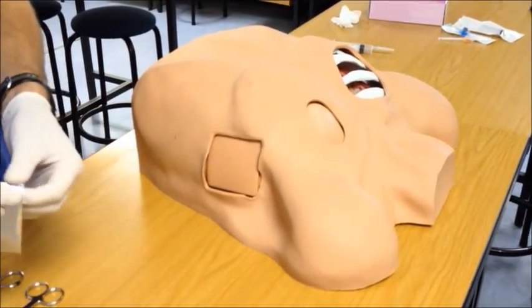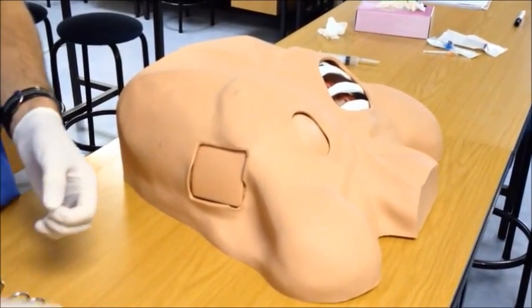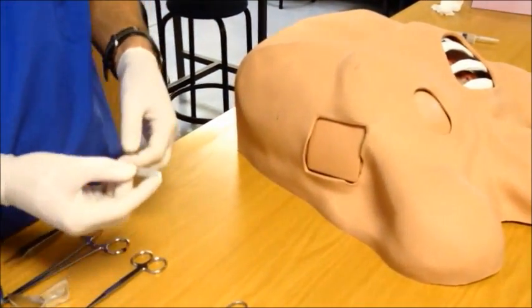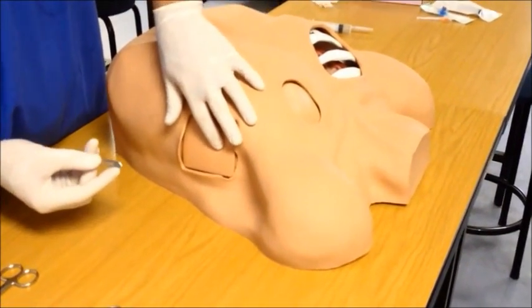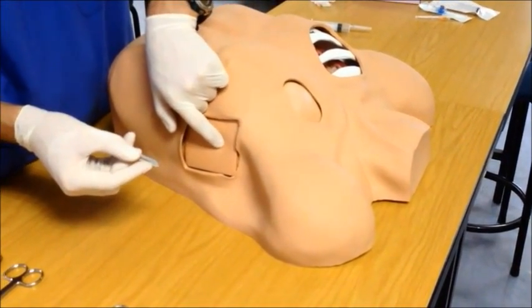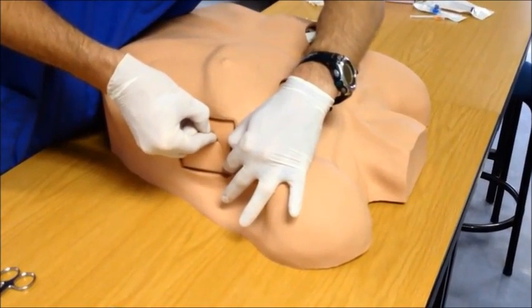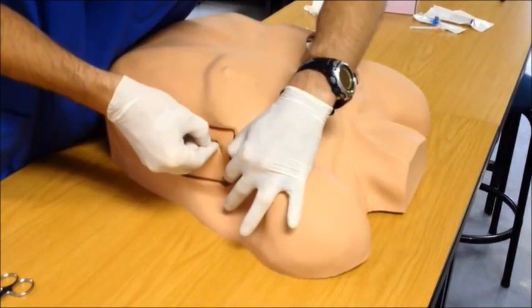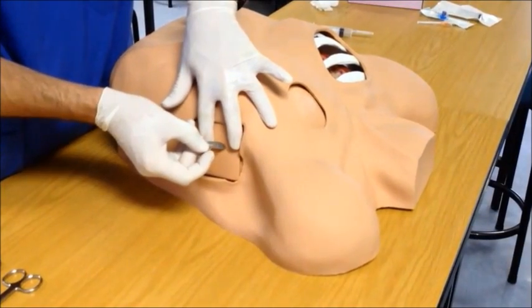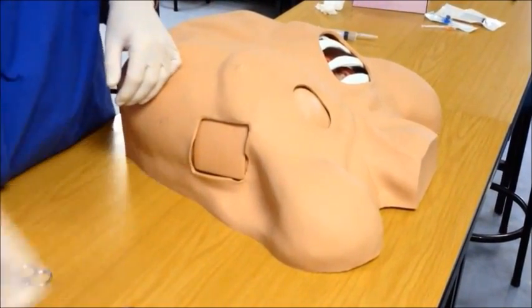Use a surgical blade to cut through the skin only. If available, use a scalpel handle, but if not available, you can use the scalpel in your hand in a safe manner. Reconfirm your area and make a 2-3 cm incision along the top edge of your landmark rib and in the direction of the rib itself. Your incision should extend only through the skin and onto the fascia and should not be used to enter the cavity itself. Dispose of your sharp safely.